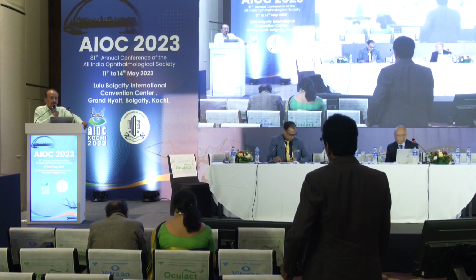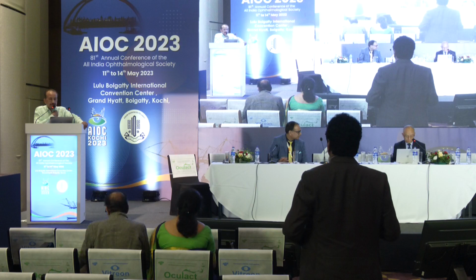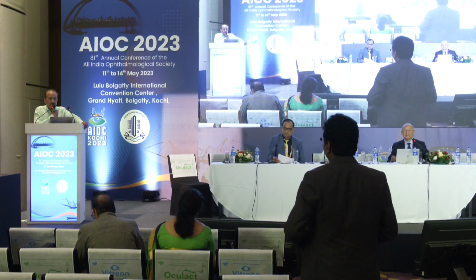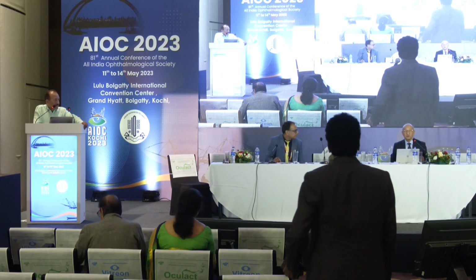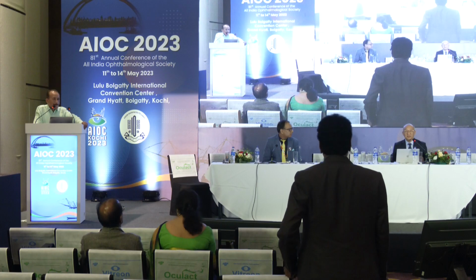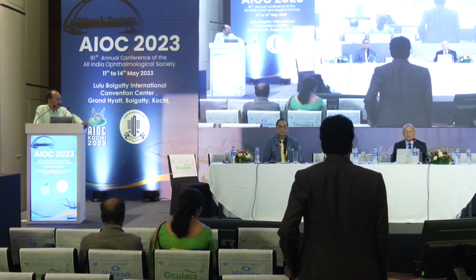Yeah, it's important. Yes. So why I asked this was because it is any day far less traumatic than excising that IOL and bringing it out. Sulcoflex, if you go for a proper sulcoflex from Rayner, it's a very costly affair. And now we have the Indian company doing these pseudophakic lenses. Yes. That can be tried.